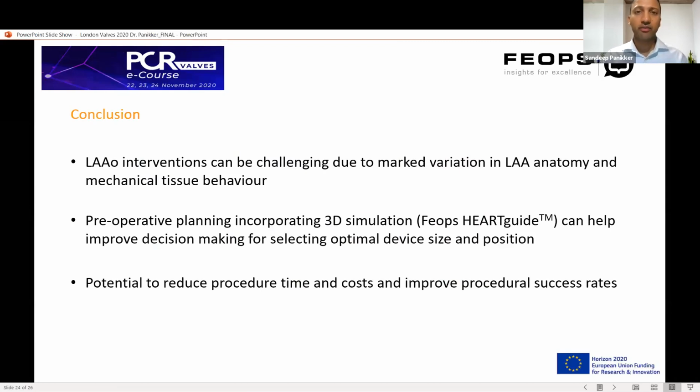And as we've seen from our previous experience, the positioning is important, and particularly gaps. If you leave things uncovered, so proximal pouches within the superior inferior margin, or if you leave gaps around the device, that's important. That will predict whether or not you're going to get DRT. And so, yes, I believe this tool can help you predict that.